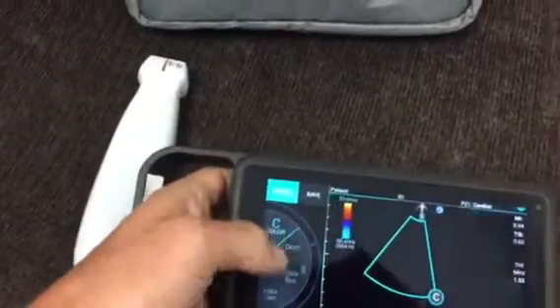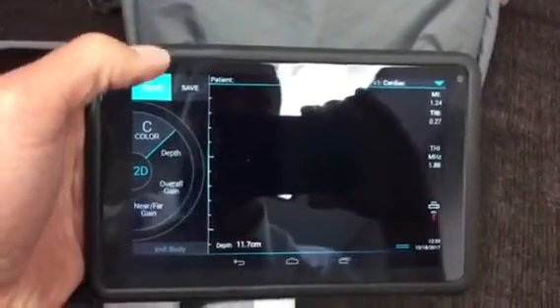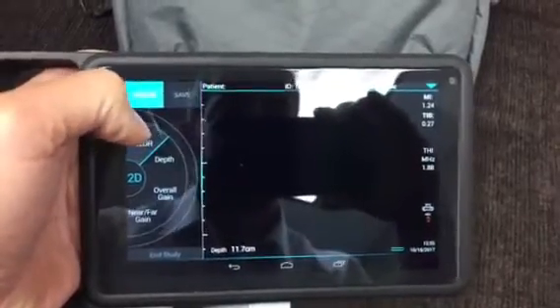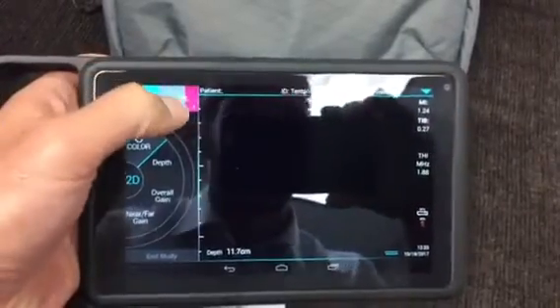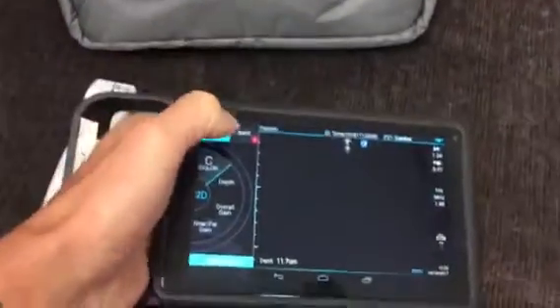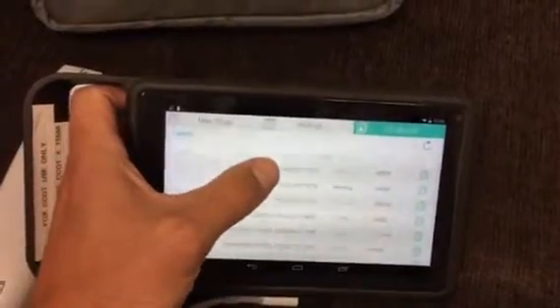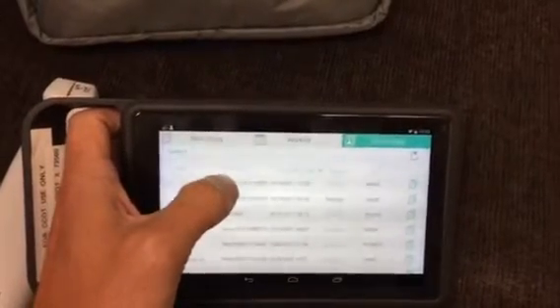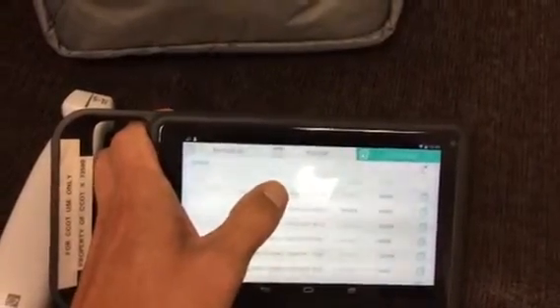Of great importance — back to 2D here — is to save images. This is wirelessly enabled just like all our machines. If you hit save once it'll save a still; if you hold save down it'll initiate a clip. A long hold of save will save a clip image. When you're done your study, end the study, and then we have a list of studies. What will happen automatically is the study will then get sent to QPath for wireless archiving — you can see there's some archive content already in the process of being sent over.